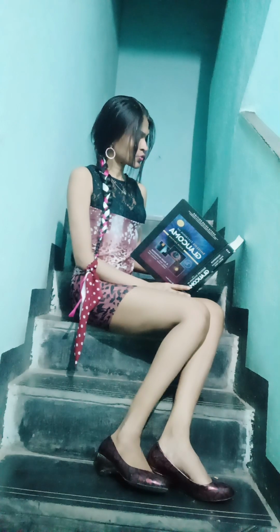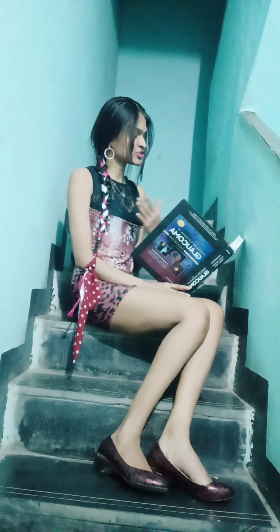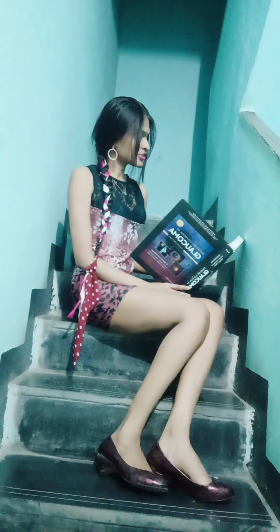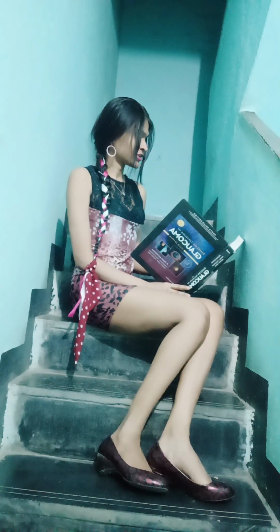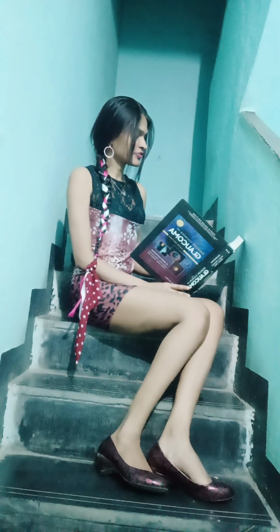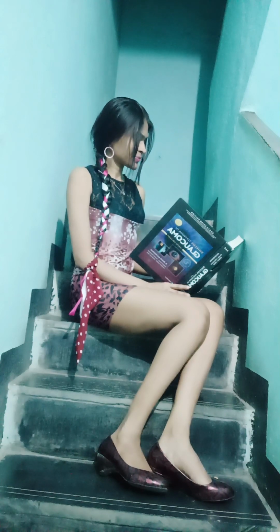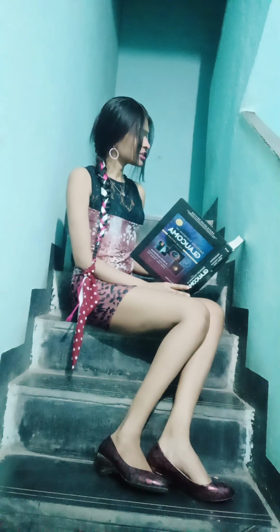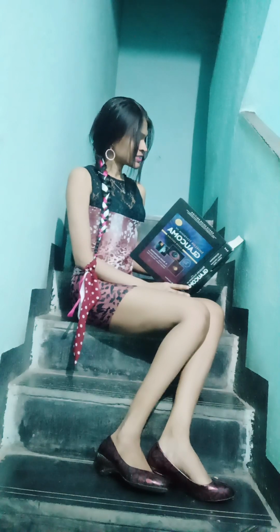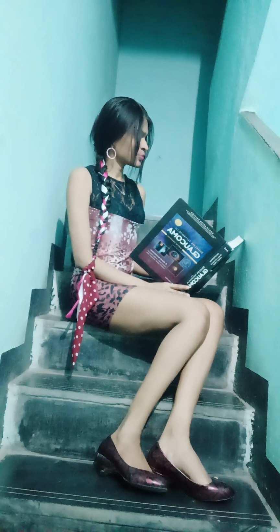In direct gonioscopy, the anterior curve of the contact lens, the gonio lens, is such that the critical angle is not reached, and the light rays are refracted at the contact lens-air interface. In indirect gonioscopy, the light rays are reflected by a mirror in the contact lens, the gonioprism, and leave the lens at nearly a right angle to the contact lens-air interface. Commonly used gonio lenses and gonioprisms are listed in Table 3.1 and some are shown in Figure 3.2.